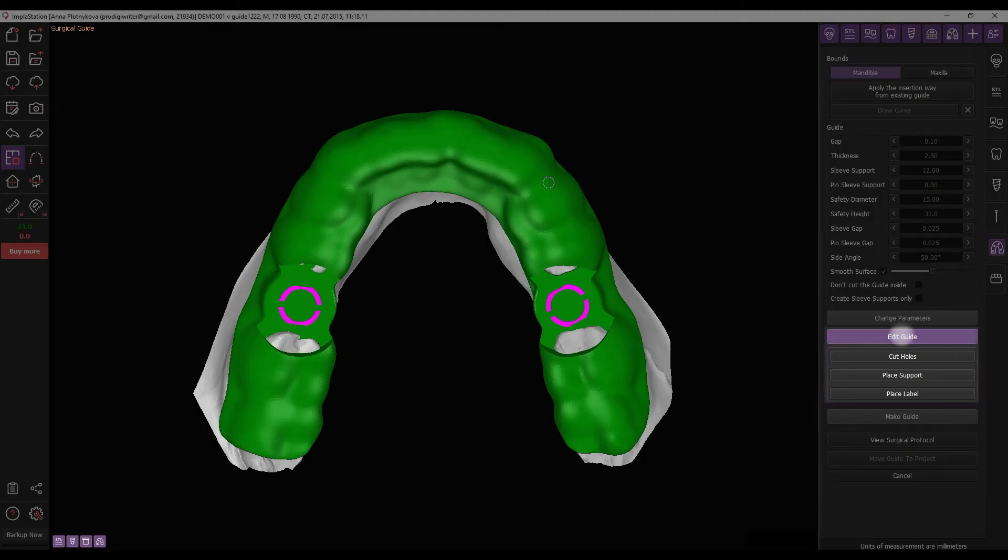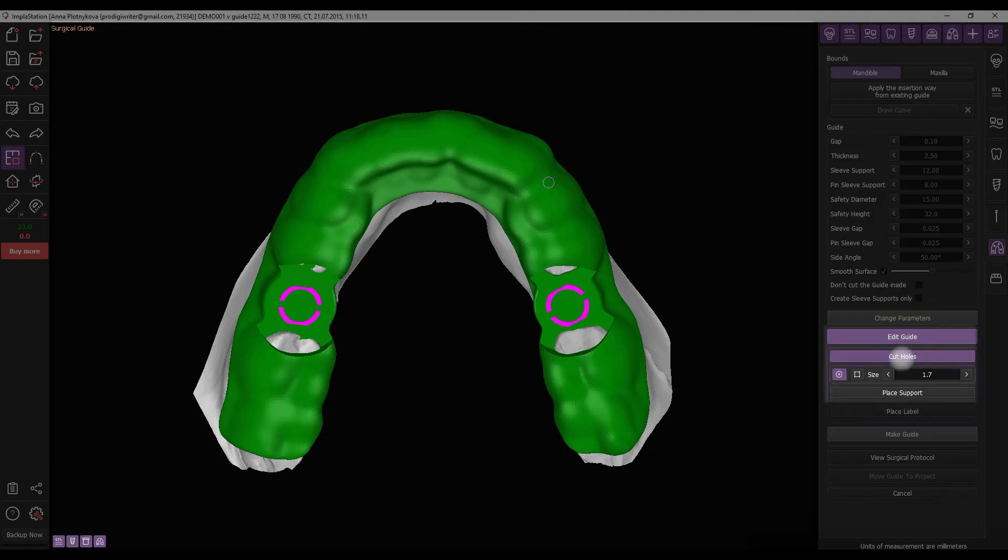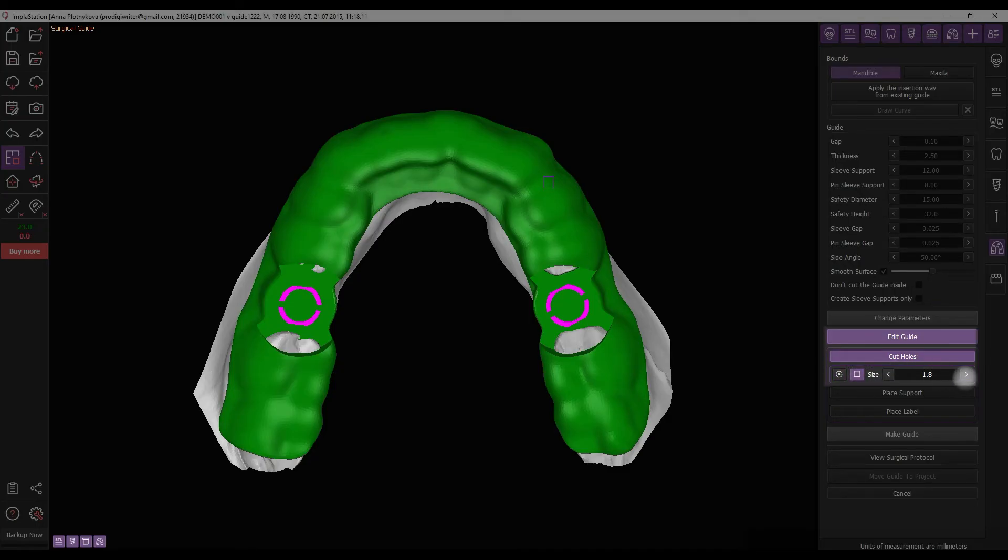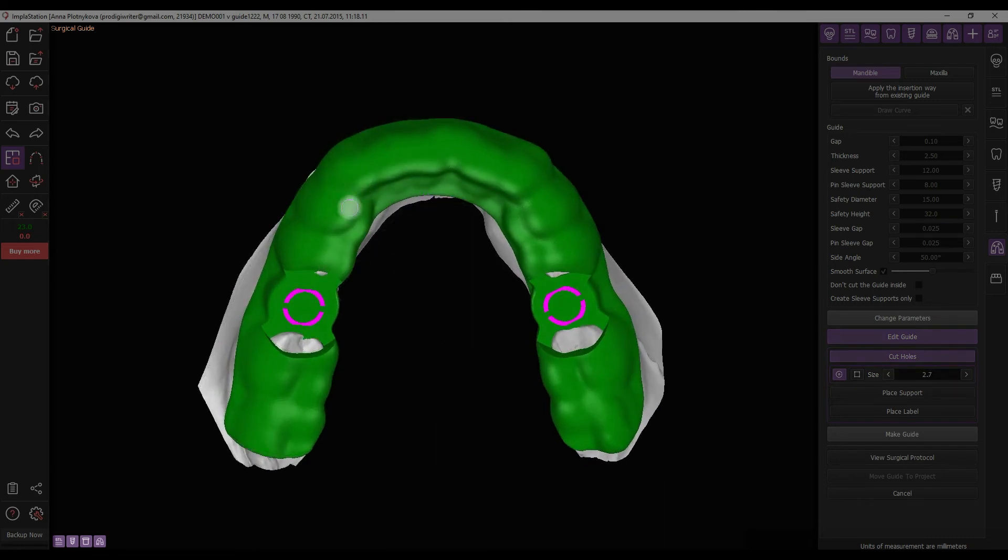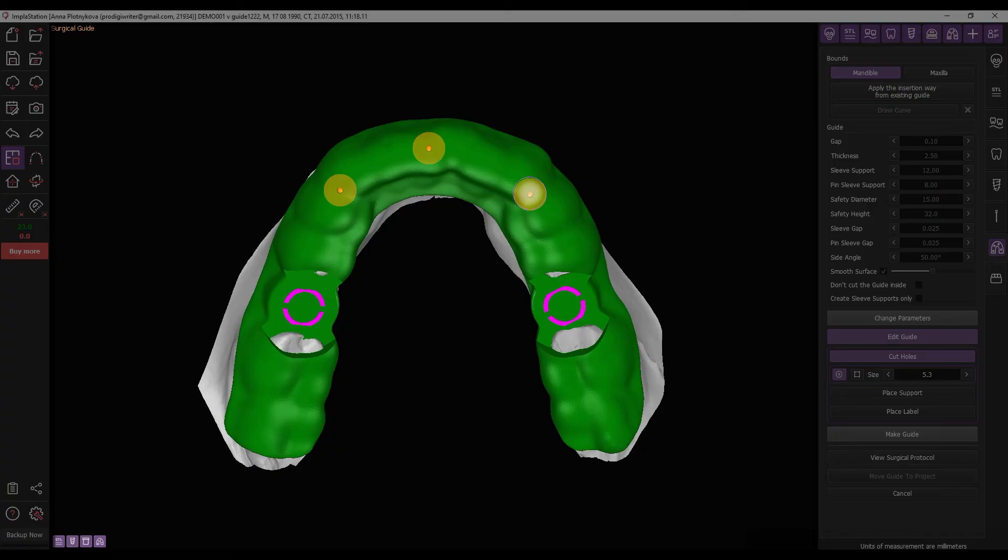For cutting inspection holes, select the Cut Holes button. Choose between round or square shapes and adjust the size using the mouse wheel or input. Use the cursor as a cutter. Left-click on the STL surface to create a hole and right-click to delete it.